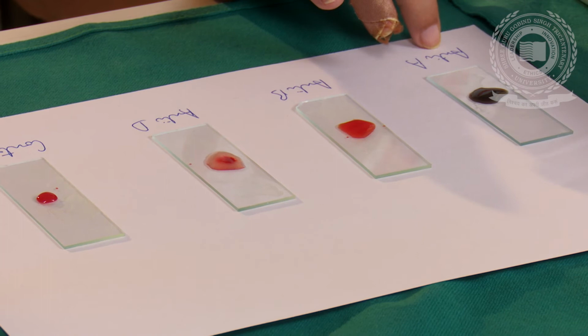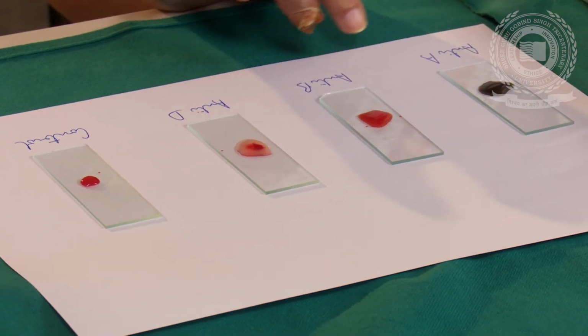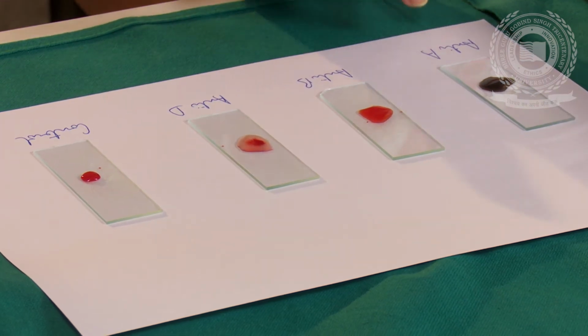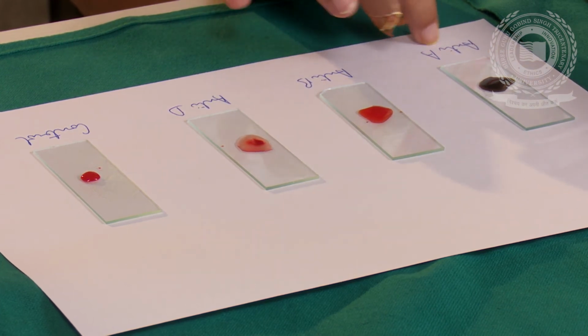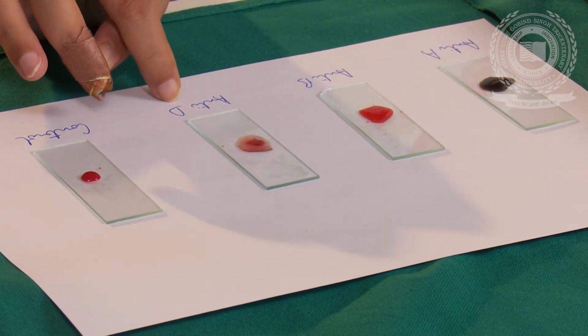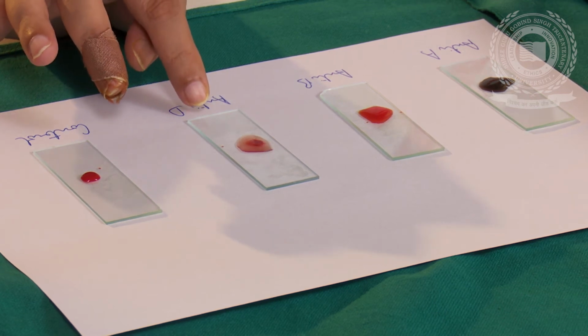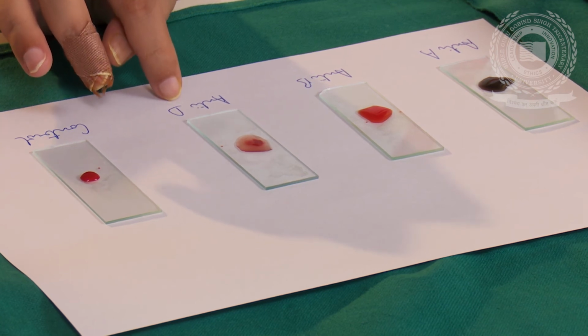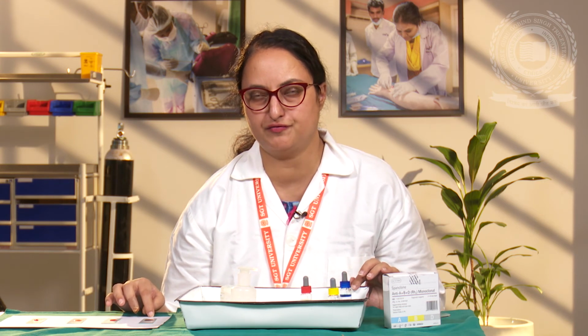It is very easy to derive the blood group from this simple procedure, as in this blood group is O positive because the blood does not have the A and B antigens. So the anti-A antibody has not reacted and the anti-B antibody has also not reacted, whereas it is O positive, that means the Rh antigen has reacted with the anti-D antibodies, and this antigen-antibody reaction has resulted in clumping. It is very easy to derive all the other blood groups from this simple procedure, and this is shown in the form of a table given at the end of this practical.